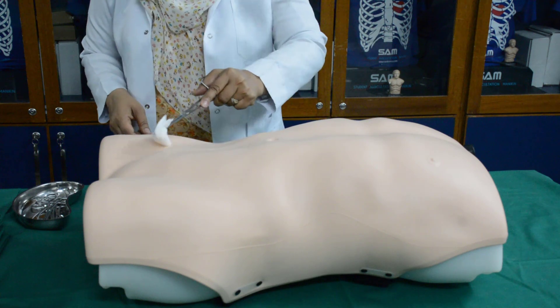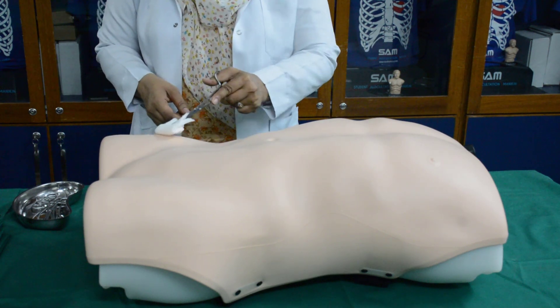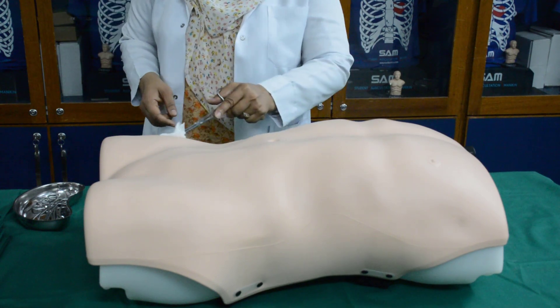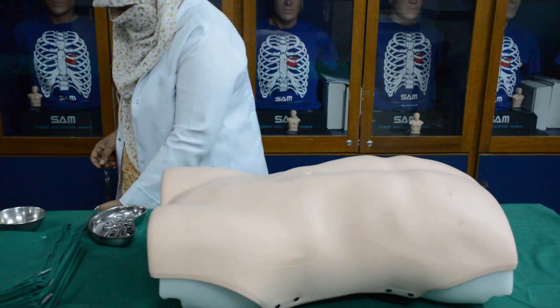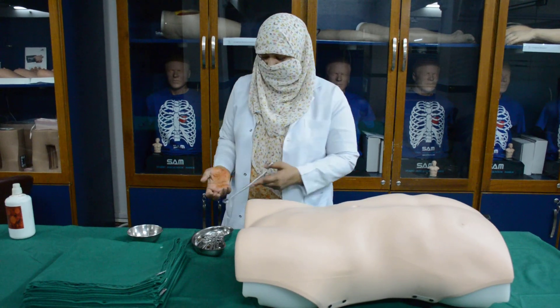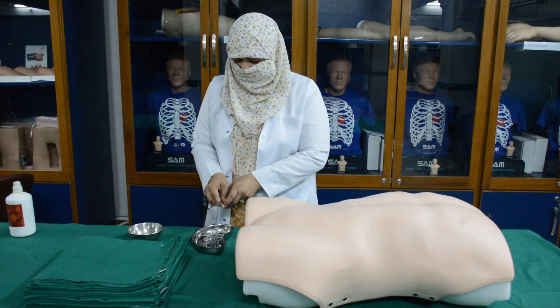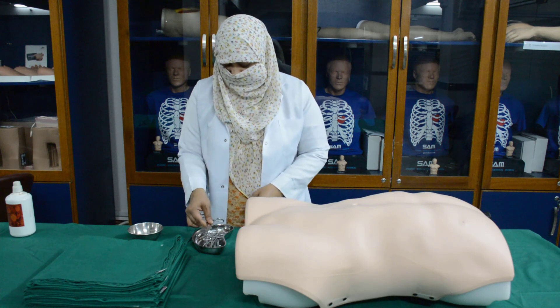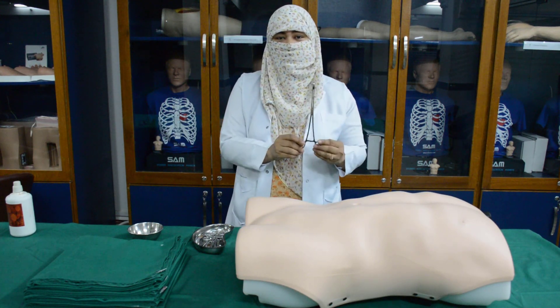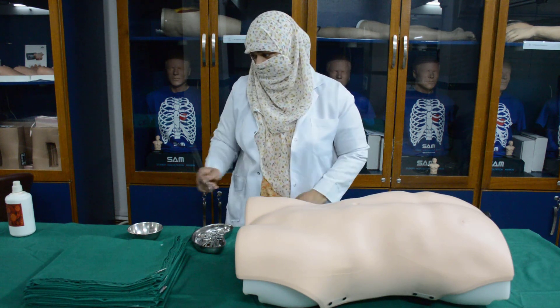For any abdominal procedure, we usually clean the abdomen from nipple to mid-thigh. After cleaning, you can clean it once more — cleaning twice is better. After cleaning, you have to put the Rampley's sponge holding forceps away from the sterile trolley; you cannot place it on the sterile trolley.